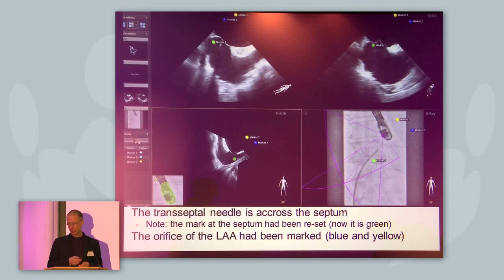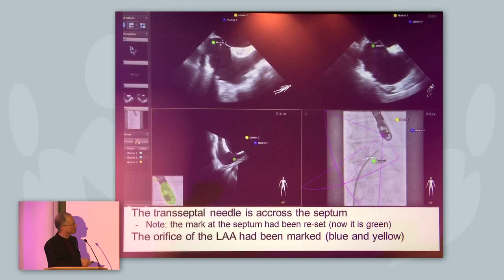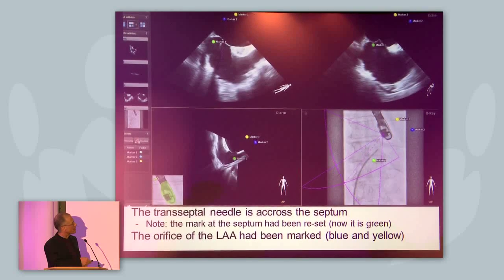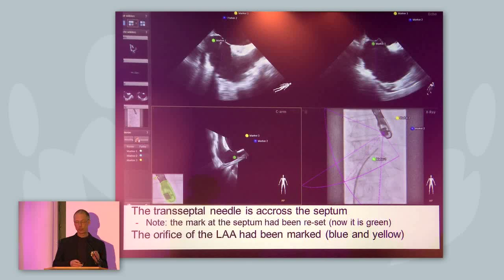The transseptal needle is now across the septum, and for some reason we had to remark the septum here, so it's green now. This is the site where you punctured the interatrial septum, and then two marks were placed at the left atrial appendage — this is the pulmonary vein ridge, and this is the circumflex — which helps you find the left atrial appendage.